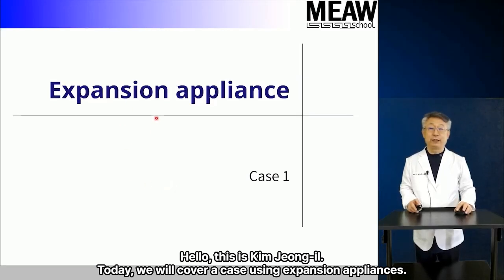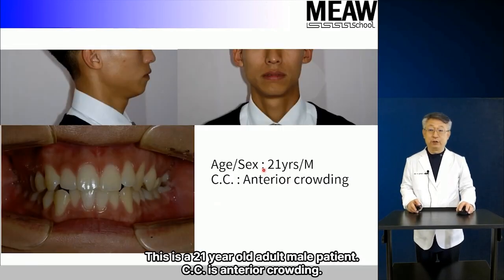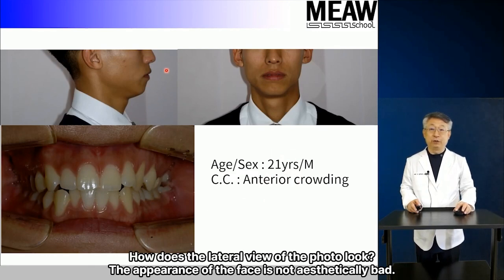Today, we will cover a case using expansion appliances. This is a 21-year-old adult male patient. The chief complaint is anterior crowding. How does the lateral view of the photo look? The appearance of the face is not aesthetically bad.